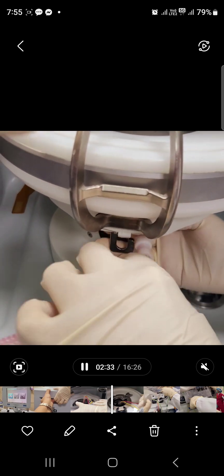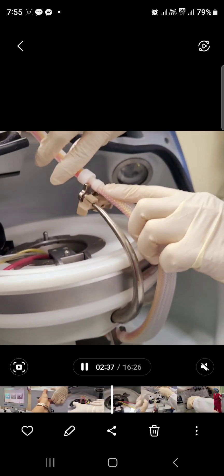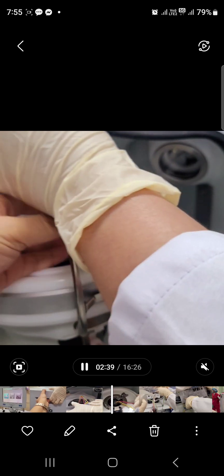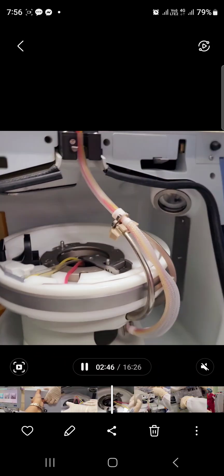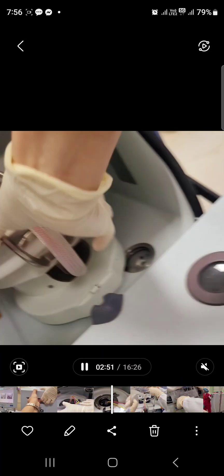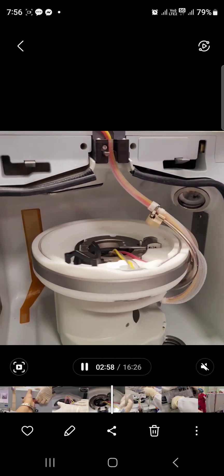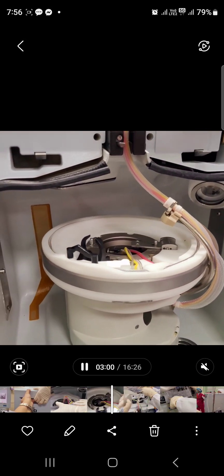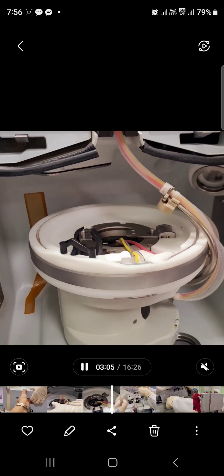Once done, anchor the tubings from the bottom part on this side and make sure they are really anchored properly. From the bottom, the last part to anchor is this one. Anchor it from the bottom to top — it's easier. Try to rotate the plate or the centrifuge and there will be light, which ensures that your tubing settings are well done.